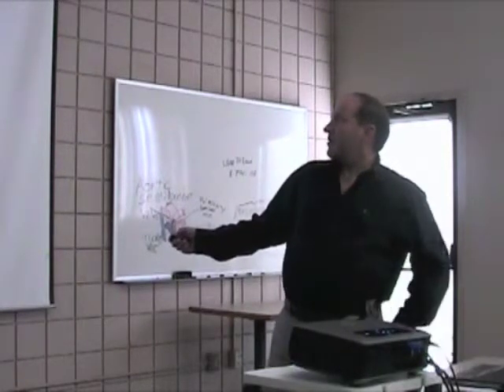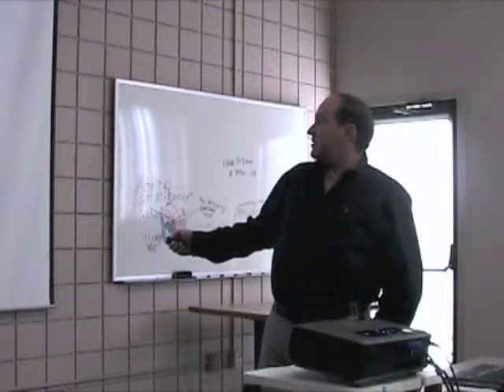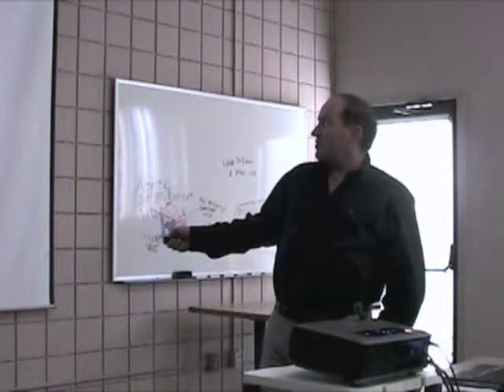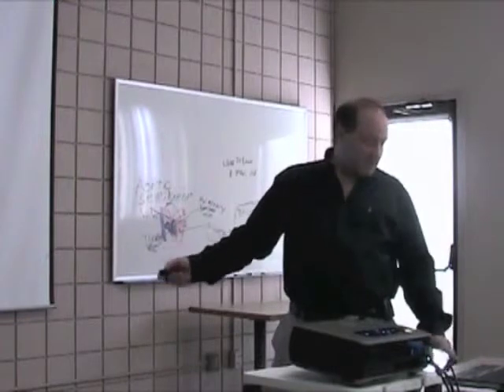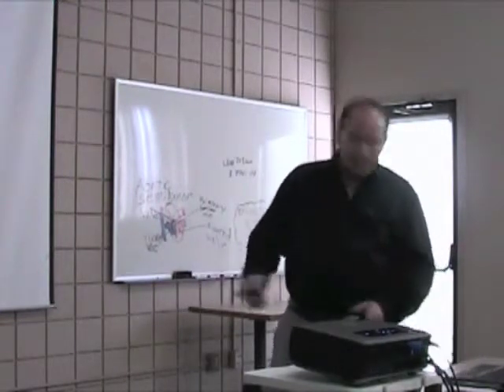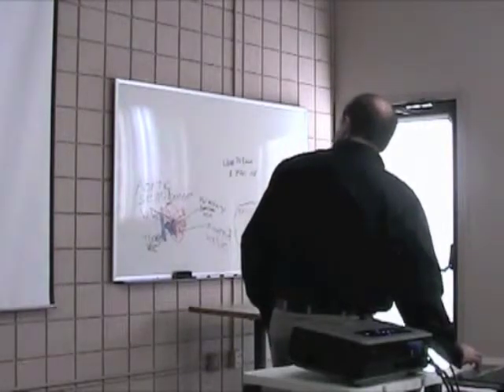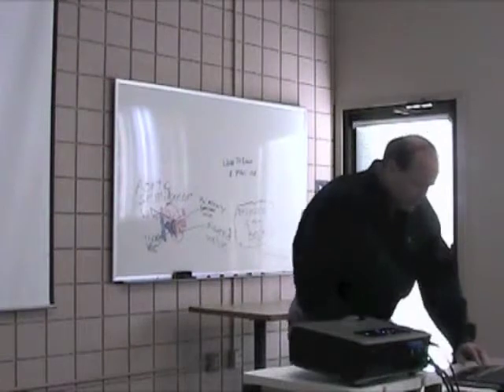And this is the Medtronic Hall valve. This is one of the mechanical valves that's available today. Introduced in 1977, it's a single block of titanium here, and then the disc here is made of carbon, pyrolytic carbon, and that's what all the mechanical valves are these days. And this is actually a Medtronic Hall valve in place.